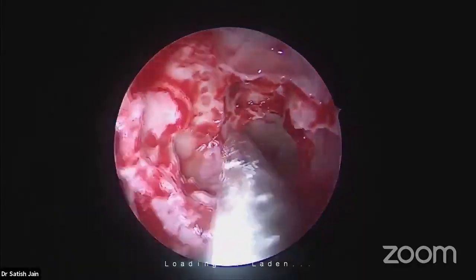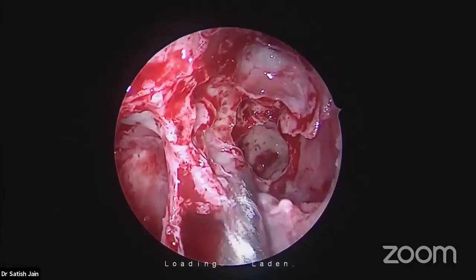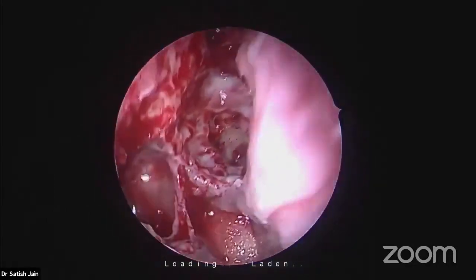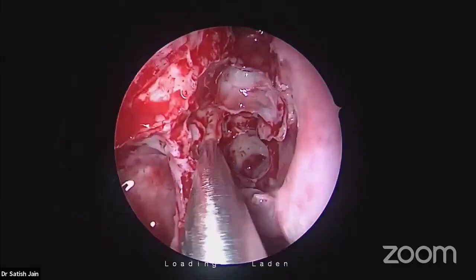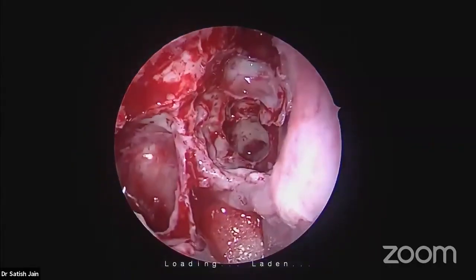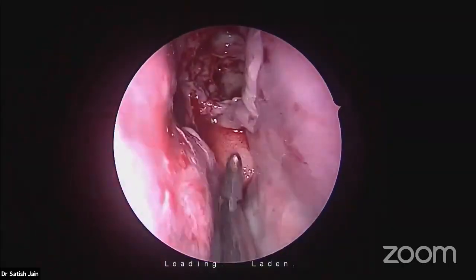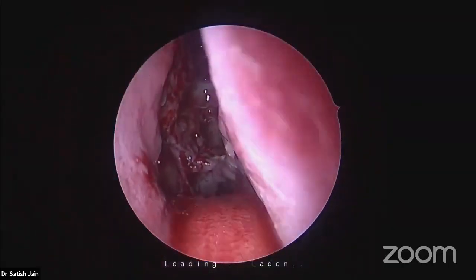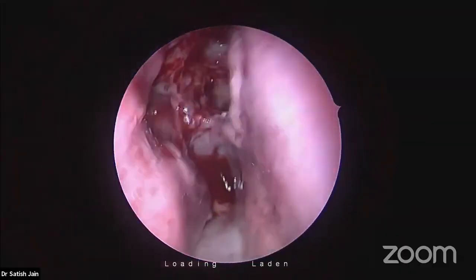The optico-carotid recess is not pneumatized. I can see the size of the sphenoid is not great, so not very pneumatized. So you see this in one view, what we have achieved is the full house FESS. The goal of surgery is two-pronged, to do a complete job, addressing all sinuses. That's why we call it full house safe FESS.